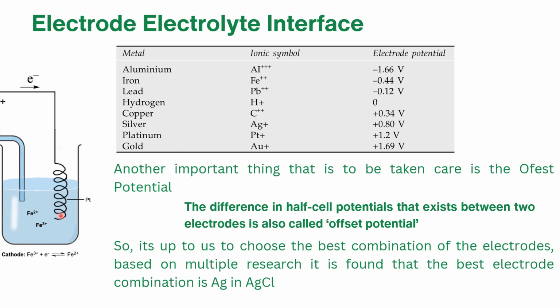As I said earlier, there will be two electrodes. One is the testing electrode, and the other one is a reference electrode. So the difference between these two electrodes should be zero actually, right? But in most cases it will not be zero, and that value we call the offset potential. Without even measuring the data, it shows some value, so we call it an offset potential.